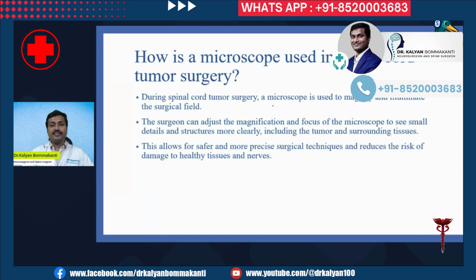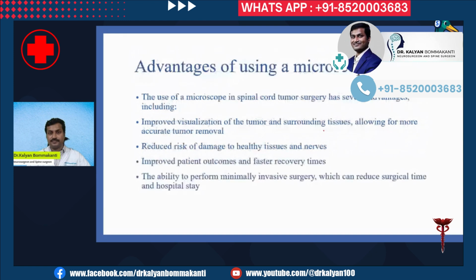So, how is a microscope used in spinal cord tumor surgery? A microscope mainly performs two functions. It is used to magnify and illuminate the surgical field. With the help of magnification, the surgeon can adjust the magnification and focus of the microscope to see small details and structures more clearly, which includes the tumor and the surrounding tissues. This allows for safer and more precise surgical techniques and reduces the risk of damage to healthy tissues and nerves.